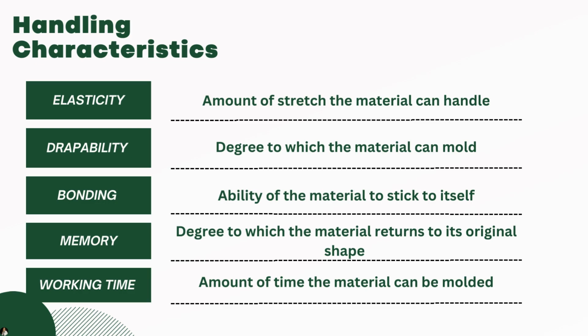Drapeability, the degree to which the material conforms to the individual's hand. So this is going to be very important for comfort and to reduce any pressure areas. The longer you heat up the material, the softer it will become and the more working time you will have. So it'll become very vulnerable to stretch.